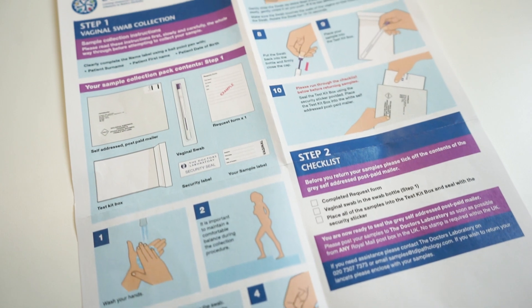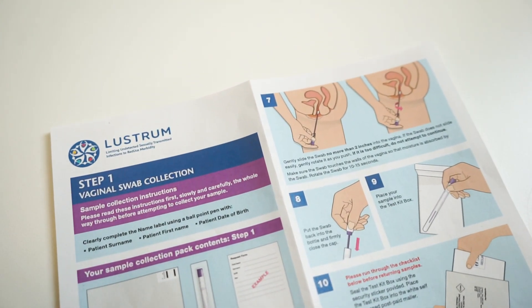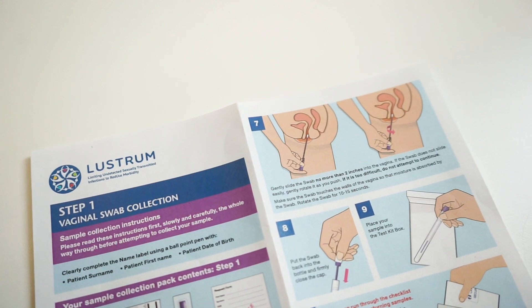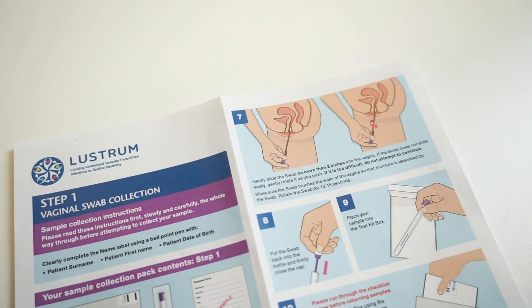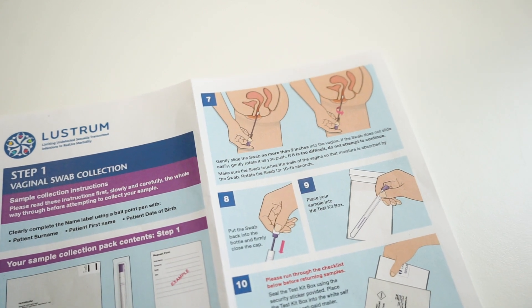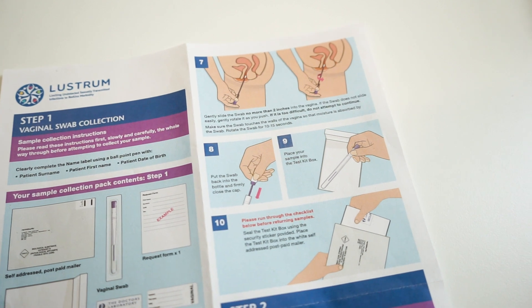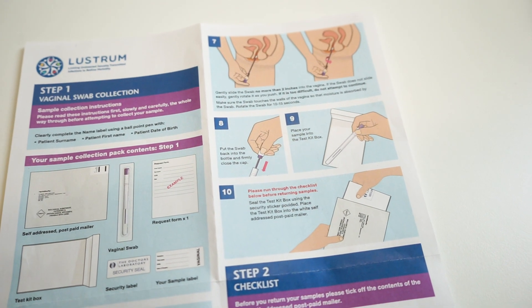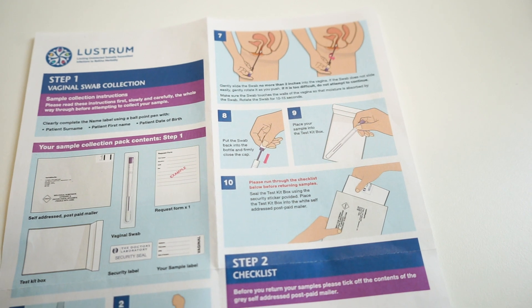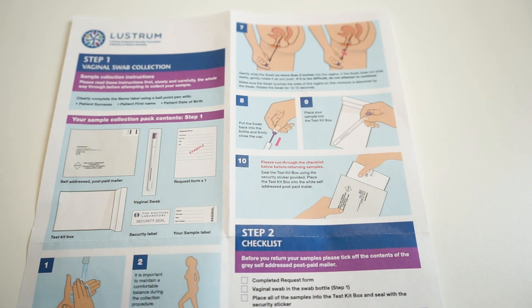Insert the tip of the swab into your vagina opening. Point the tip towards your lower back and relax your muscles. Gently slide the swab no more than two inches into your vagina. If the swab does not slide easily, gently rotate it as you push. If this is too difficult, do not continue and contact the health advisors who can support and advise you. Make sure the swab touches the walls of your vagina so that moisture is absorbed by the swab. Rotate the swab for 10 to 15 seconds.